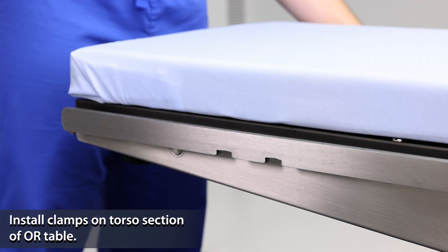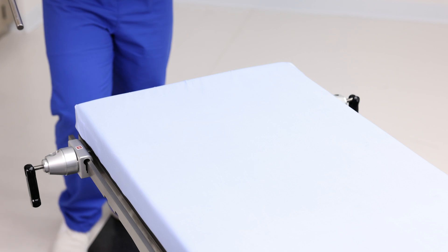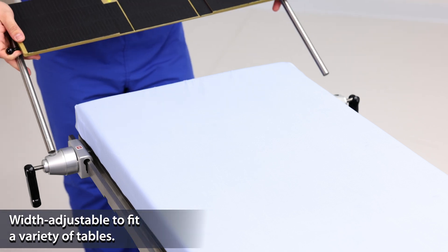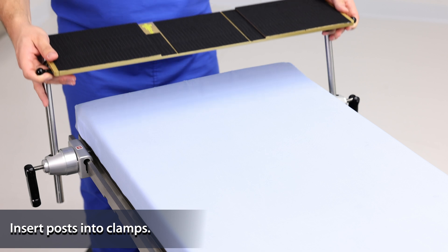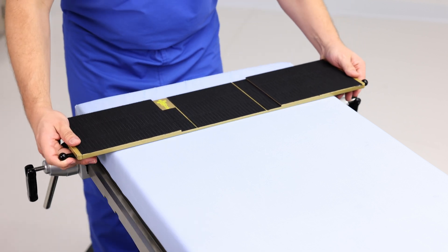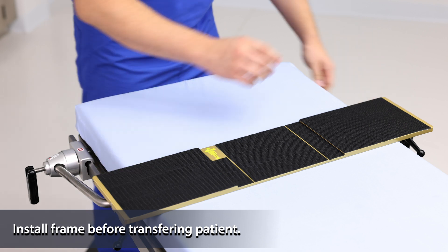First, install the clamps. Make sure they are fully open before snapping onto the rail. Dynamic frame mounting posts are width adjustable to fit a variety of tables. Insert the posts into the clamps to install the frame on the table. The clamps allow dynamic adjustment of the frame along the length of the table.